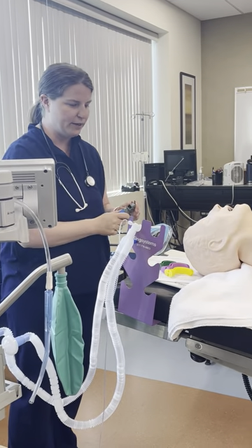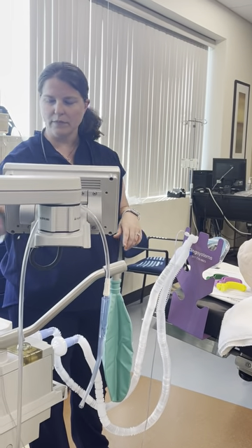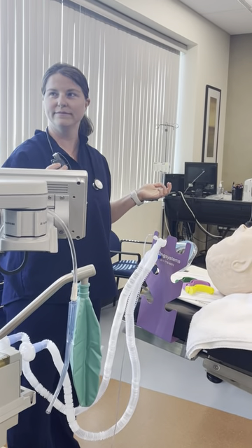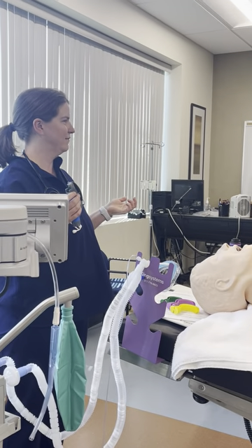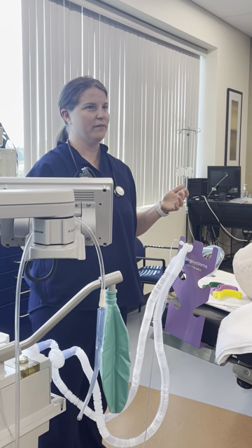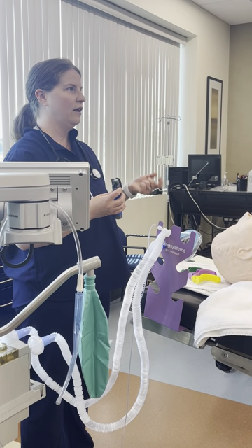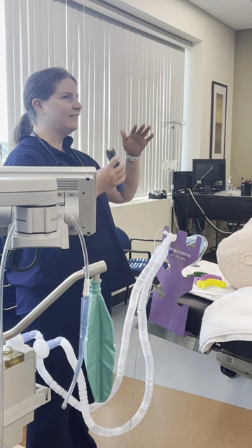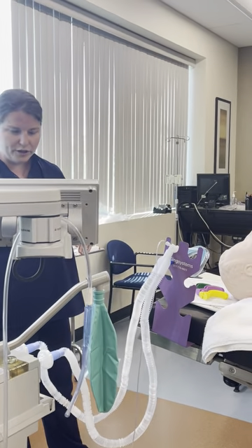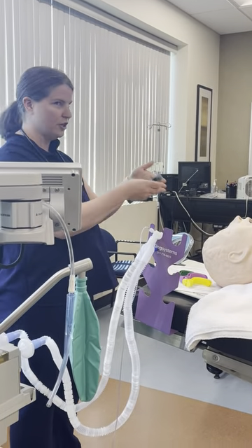There is a difference in blade placement. The tip of the MAC blade goes into the vallecula — that's the space between the epiglottis and the base of the tongue. So if your MAC blade is placed appropriately in somebody's mouth, you will still see the epiglottis hanging, kind of like a curtain, in front of your view of the cords. With the Miller blade — the straight blade — you lift the epiglottis, so there's no epiglottis in the way and you should just see the cords.